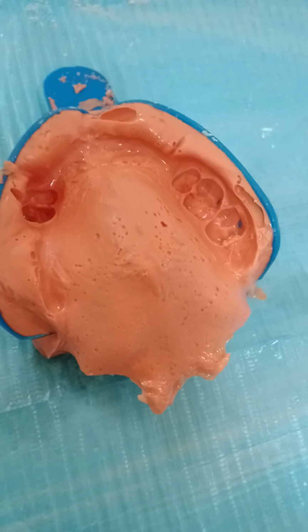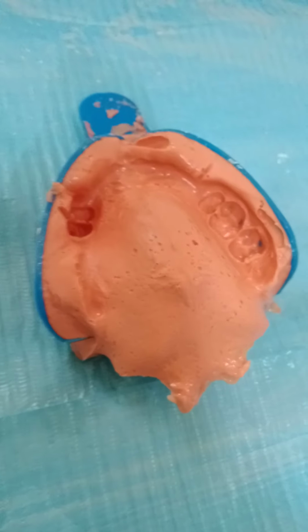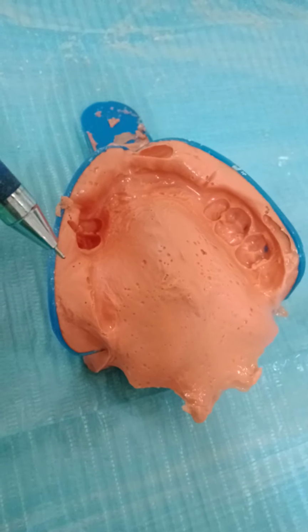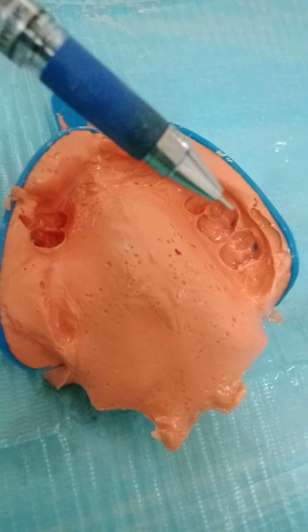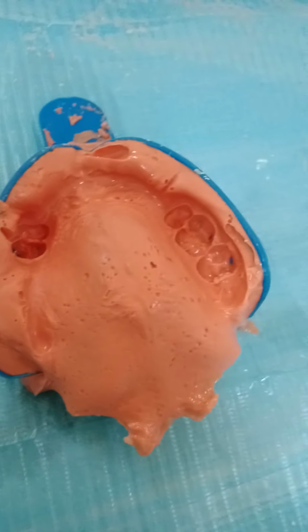You are not aiming to do a secondary impression. Yeah, because he could not come. No, please do a secondary tray. Because of all of these problems. This is our largest tray, and still it's small and it's hitting the teeth. I didn't take these teeth correctly buccally. Why do I need to take them correctly buccally? Because I need them for clasping. I needed them for retention.